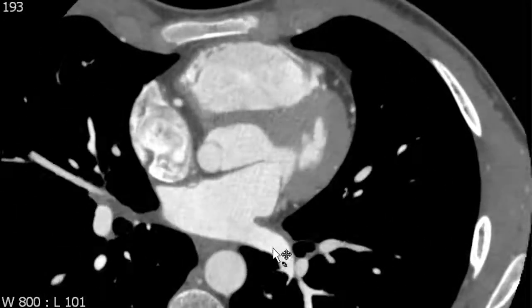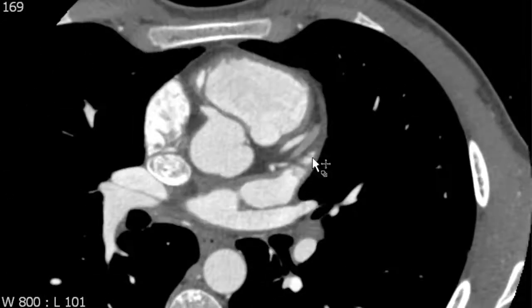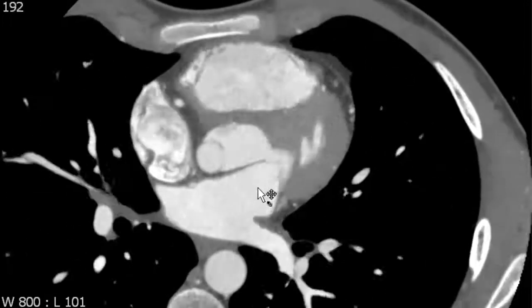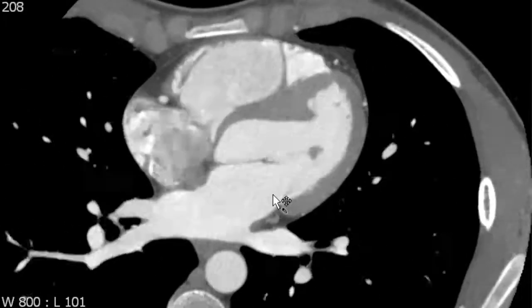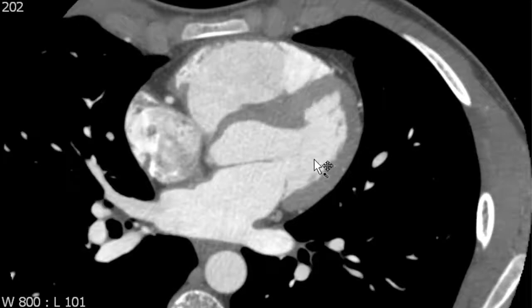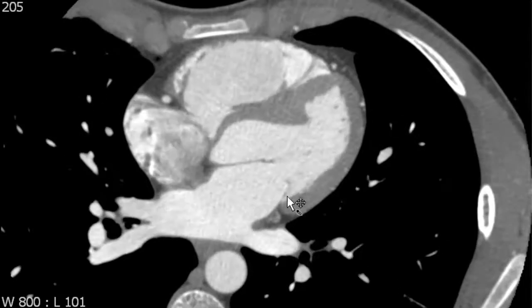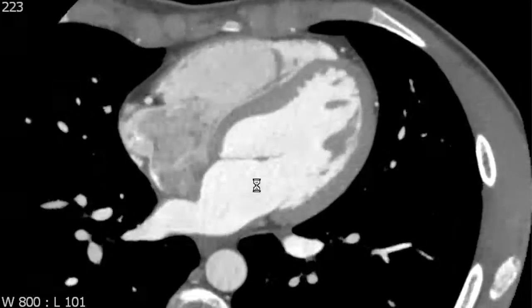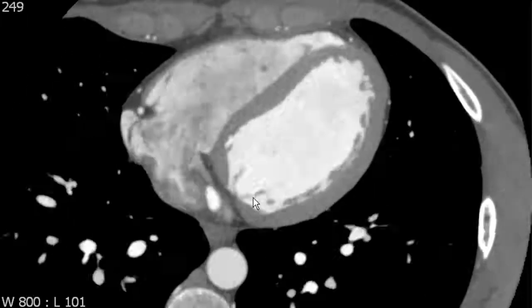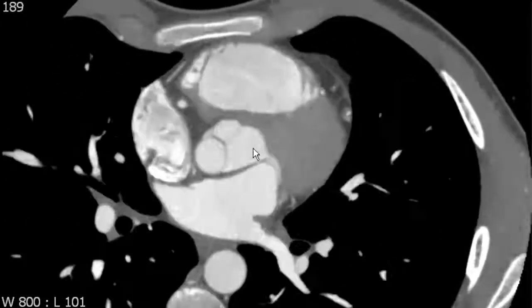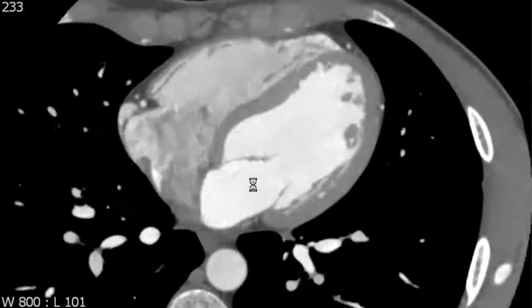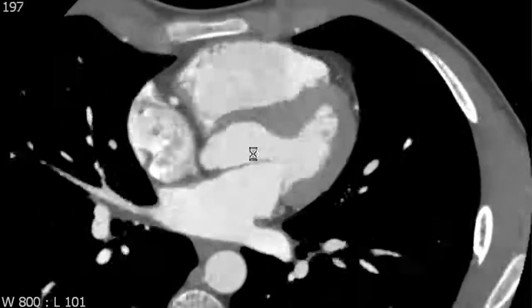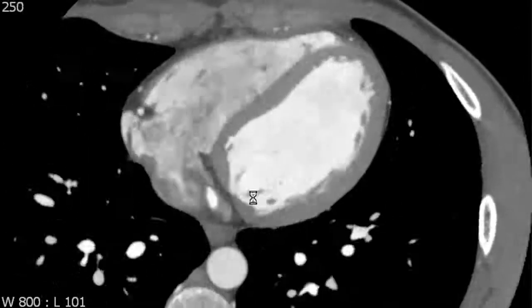The left atrium receives blood through the pulmonary veins, has the left atrial appendage which can be a site of thrombus formation, and blood subsequently flows through the mitral valve into the left ventricle. The shadow of the mitral valves can be made out and are fairly well seen in this particular case, although frequently they will not be well seen depending on how successful your cardiac gating is.